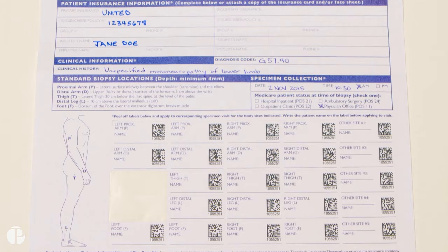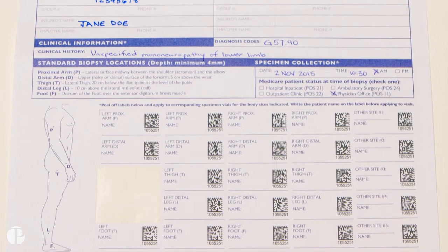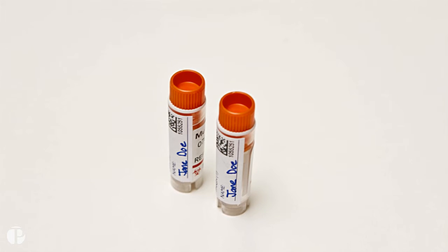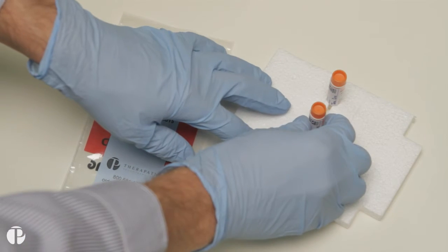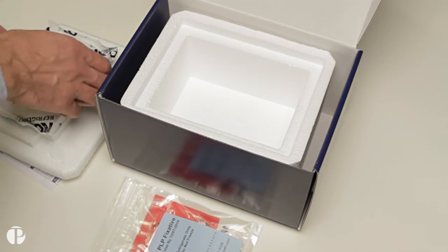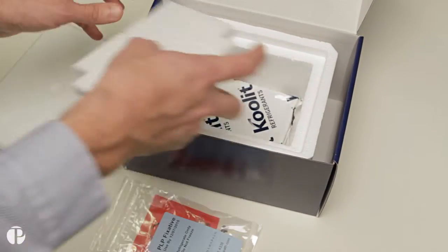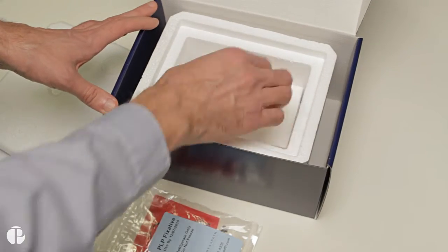Use the labels for the requisition form to label the vials with the patient's name. For shipping the samples back to Therapath, place the labeled vials in the biohazard bag. You will need the cooler and frozen ice pack for return shipping. Place the ice pack at the bottom of the cooler and add the foam barrier to the top of the ice pack.